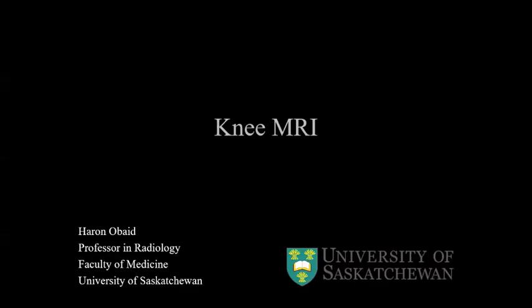This talk is to cover a major joint in MSK, which is the knee joint. I give this talk to the residents all the time.